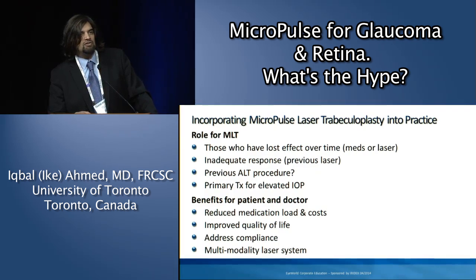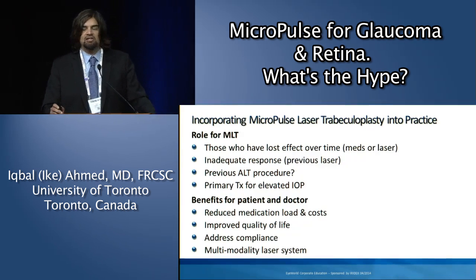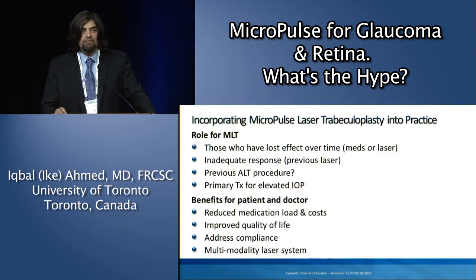I think the benefits of getting away from medications are well known. We've covered that already. I think the compliance issues are important, and one of the big things in a lot of our practice is the ability to perform more than simply trabeculoplasty. We use this laser for iridoplasty, for plateau iris, pupilloplasty, for changing the pupil size if necessary, for multifocal or for a traumatic case. We use it for laser suture lysis and a variety of different applications.